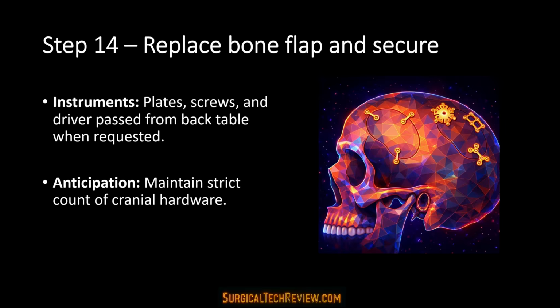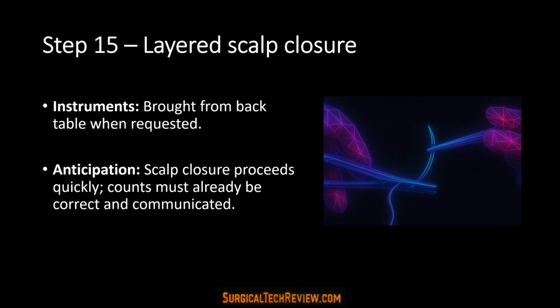Step 14. Replace the bone flap. The bone flap is replaced and secured with plates and screws. All cranial hardware is carefully counted and confirmed. Step 15. Layered scalp closure. The scalp is closed in layers. A drain may be placed, and closure proceeds quickly at this stage.